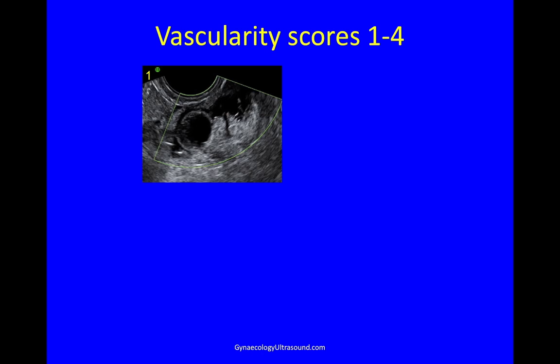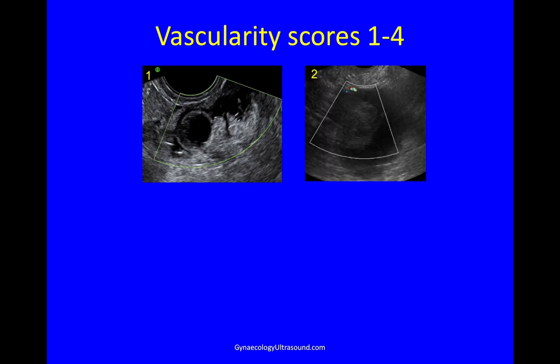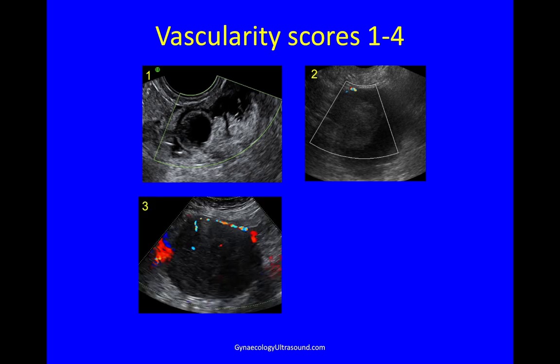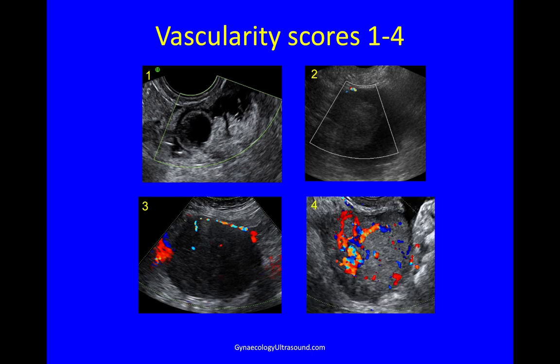A score of one: you can see the colour box and there is no evidence of any colour at a PRF of 0.3. At 0.6, a hint of colour at the edge is a two. When you turn it on and it's just there, that's a three. Strong irregular colour throughout the mass is a four.